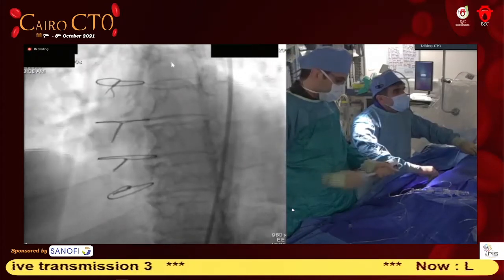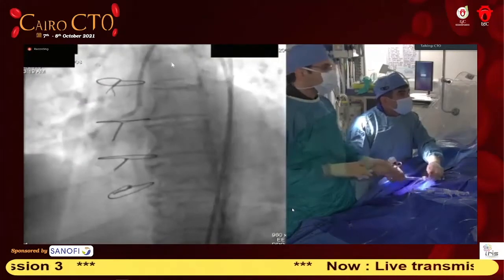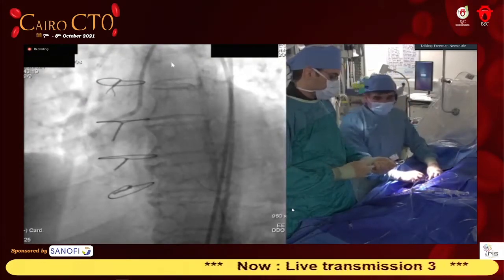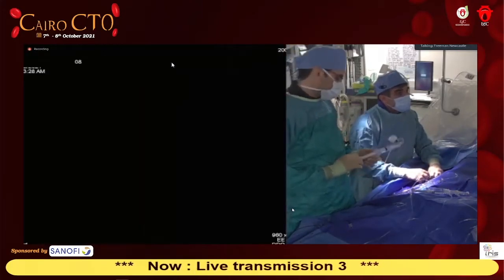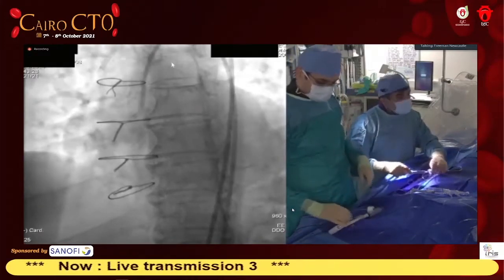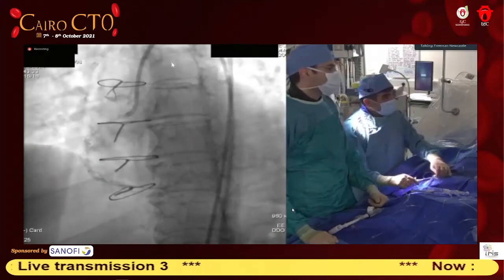16. There is a question about a temporary wire before doing the procedure. Do you do that? No. Come down. It's been more than, oh God, not with CTOs, rarely, ever. Even with the primaries, we rarely use rotablation, rarely use that. Store that.